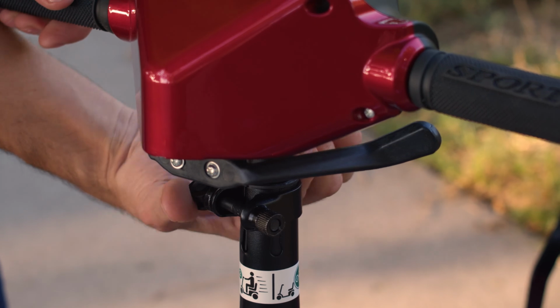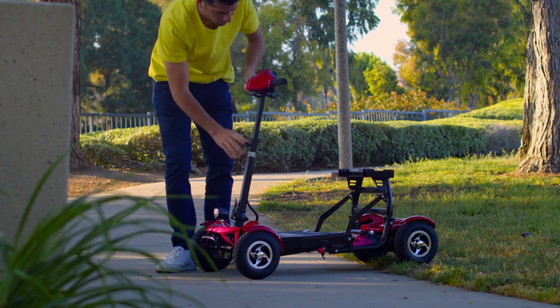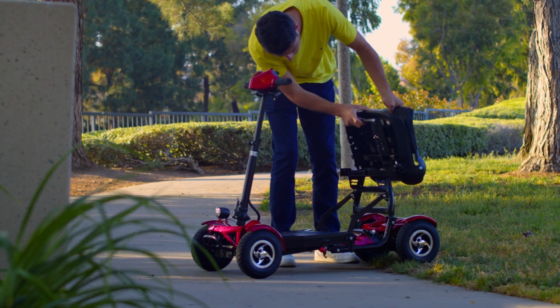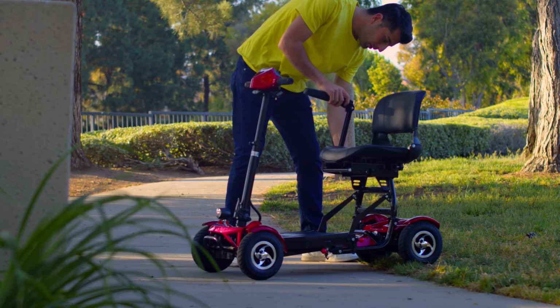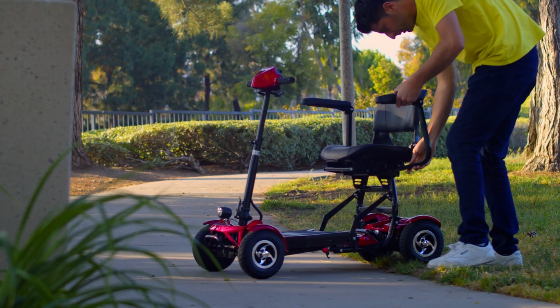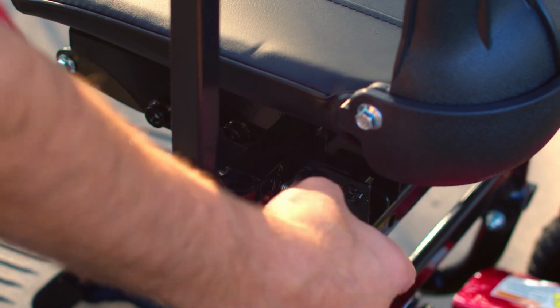This is how we adjust the handlebar. And this is how we are installing the seat plus armrests. Make sure you tighten the screws of the armrests.